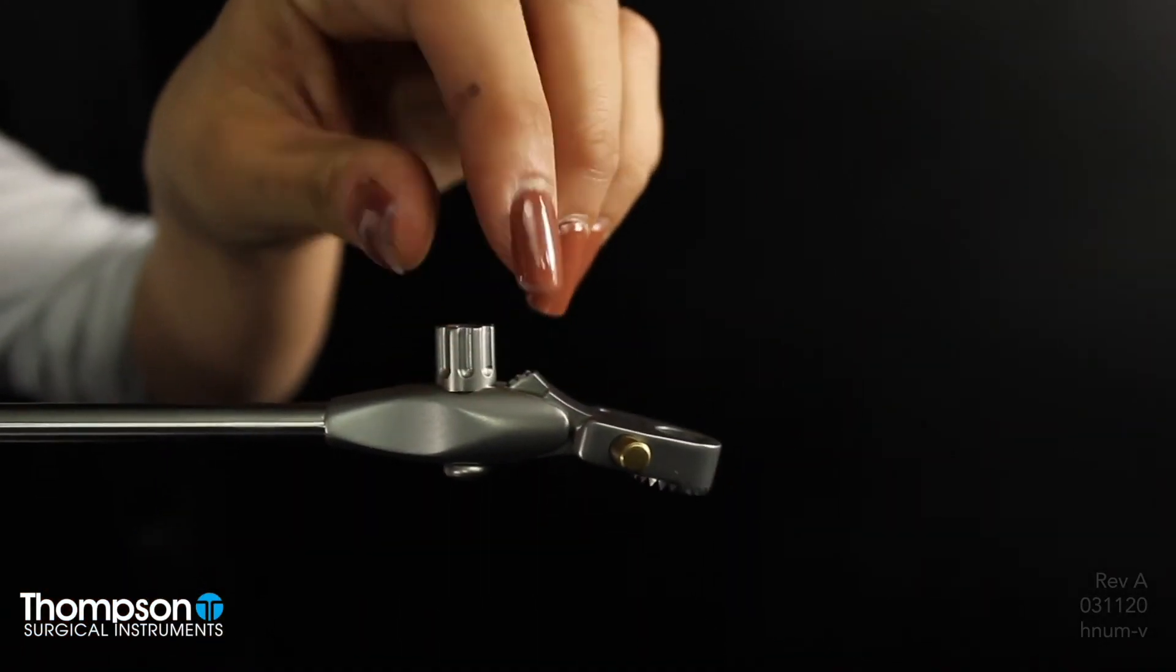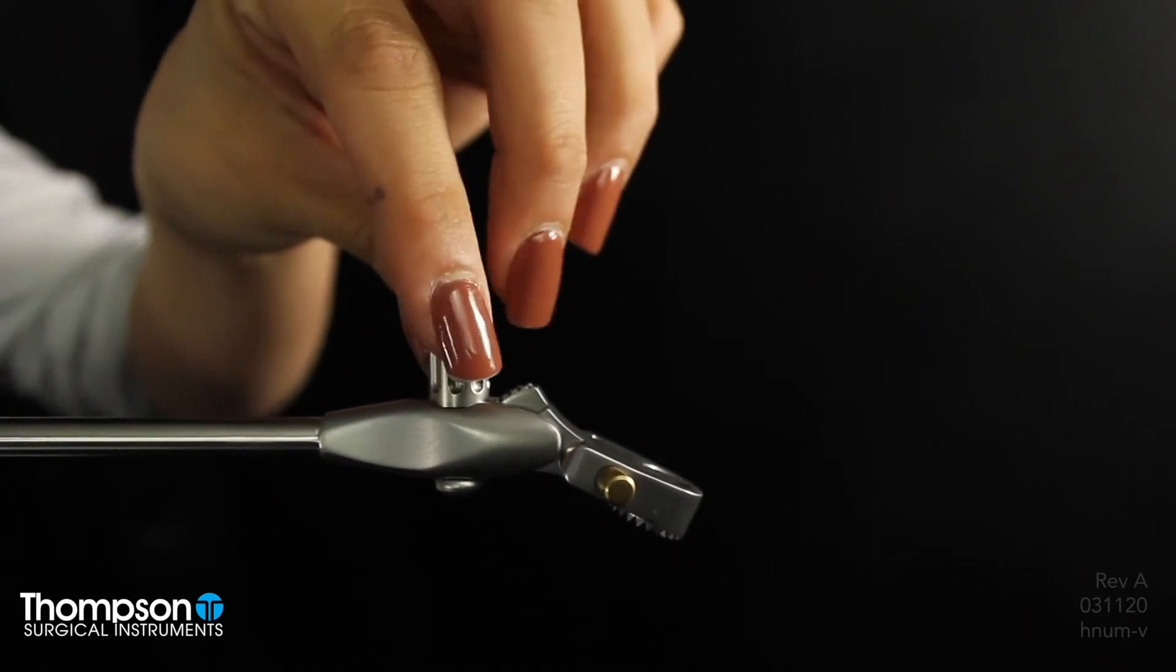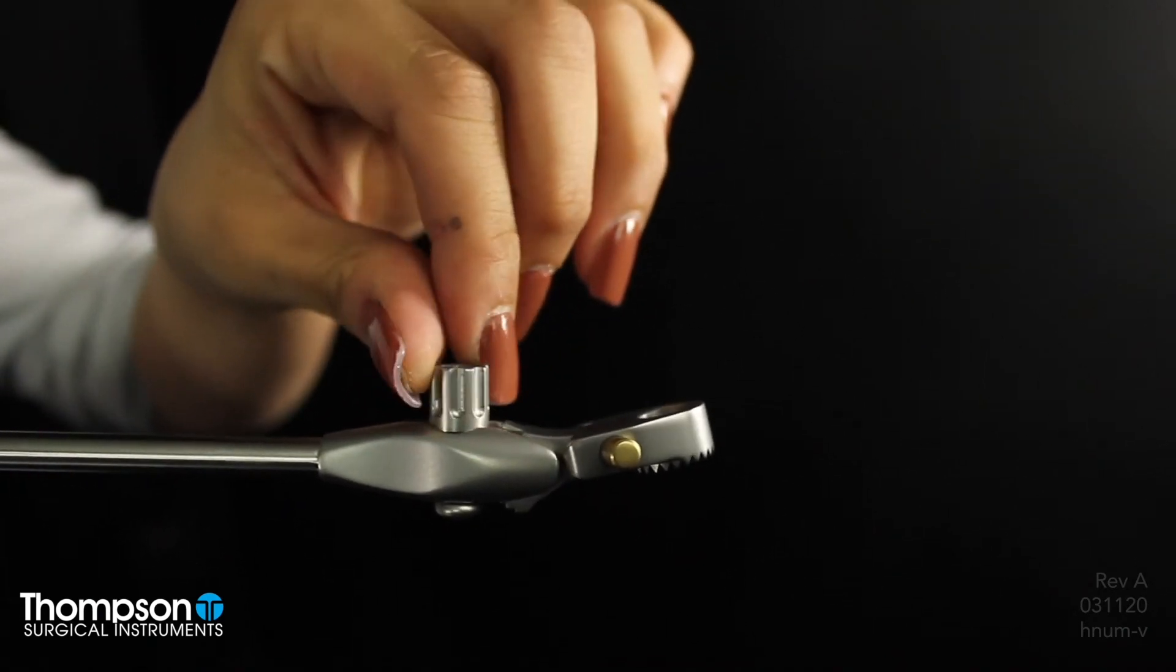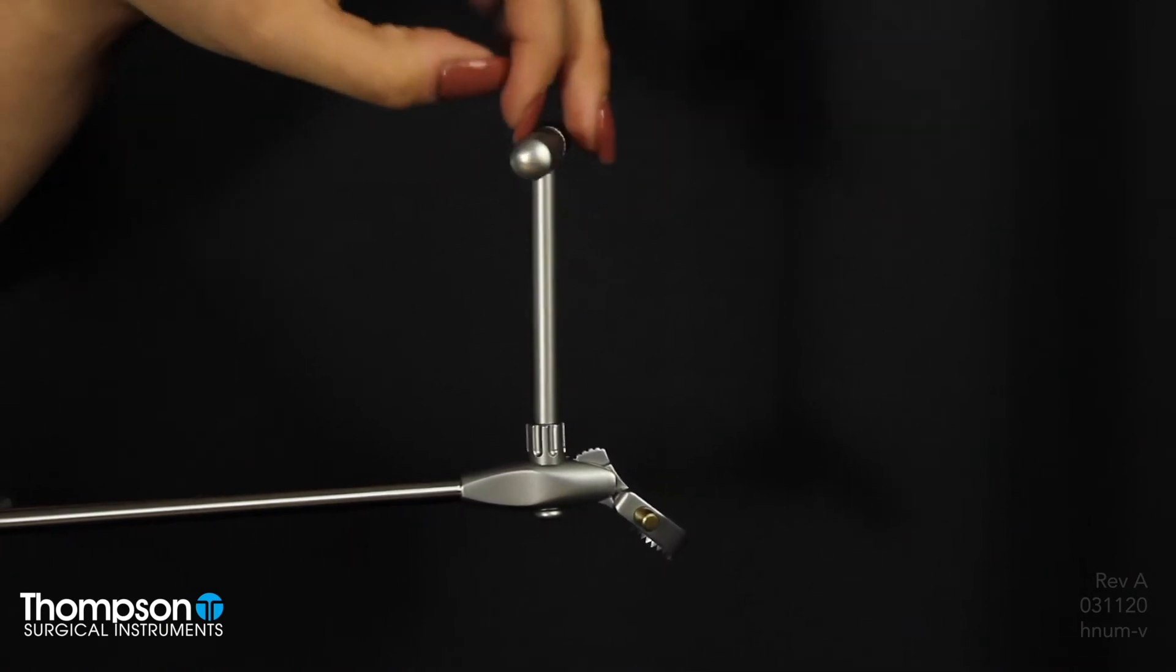Thompson's quick angle handles offer the ability to toe the blade up or down 45 degrees by turning the quick angle knob with fingers or under heavy retraction with the included T-handle.